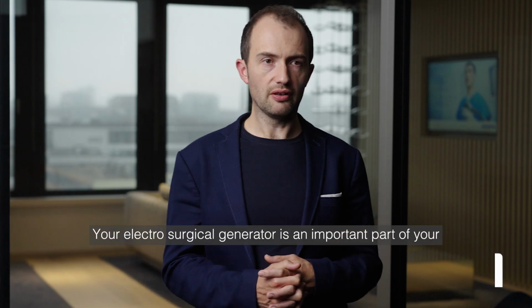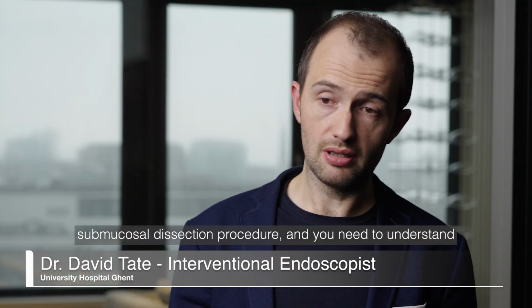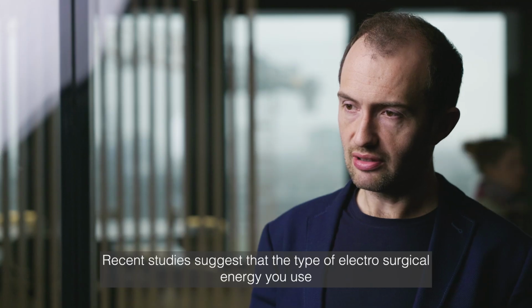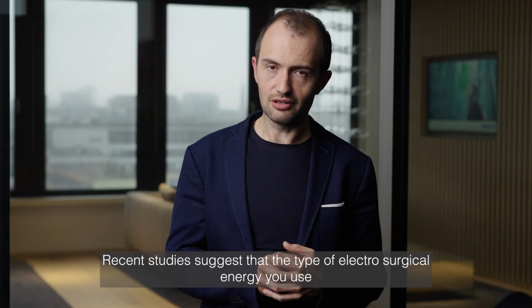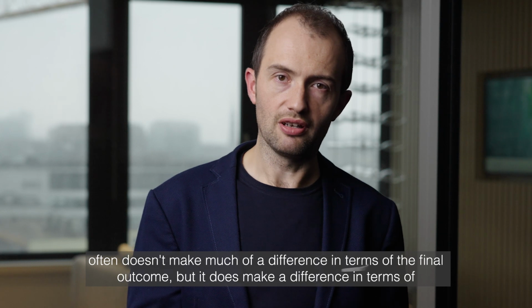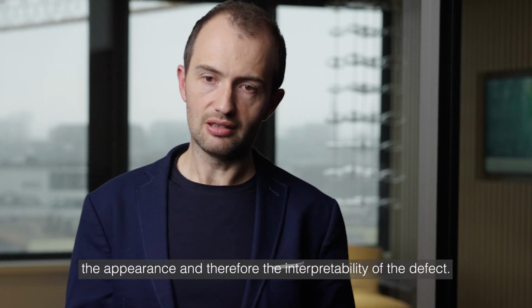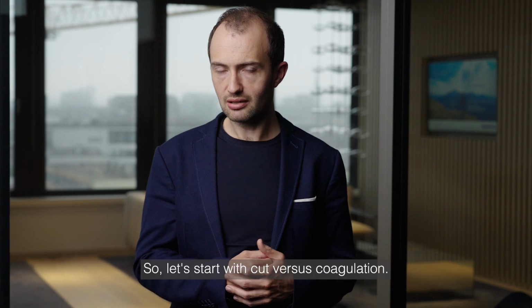Your electrosurgical generator is an important part of your endoscopic submucosal dissection procedure, and you need to understand what the different settings are and what they do. Recent studies suggest that the type of electrosurgical energy you use often doesn't make much of a difference in terms of the final outcome, but it does make a difference in terms of the appearance and therefore the interpretability of the defect, and it does make a difference in terms of the use of cut versus coagulation. So let's start with cut versus coagulation.